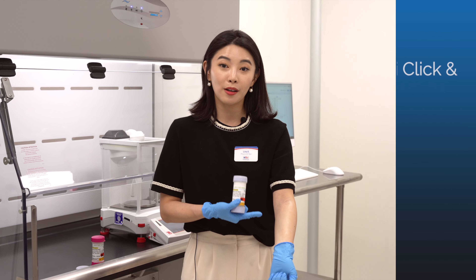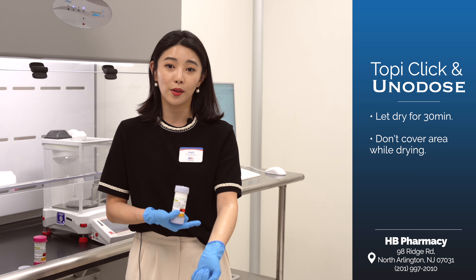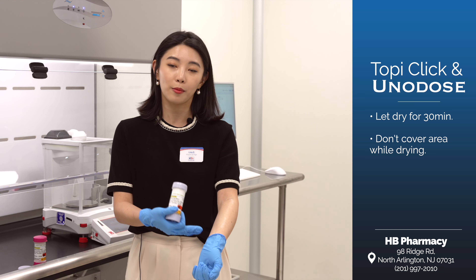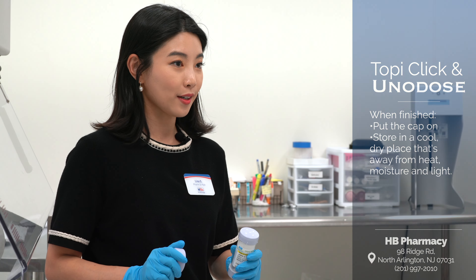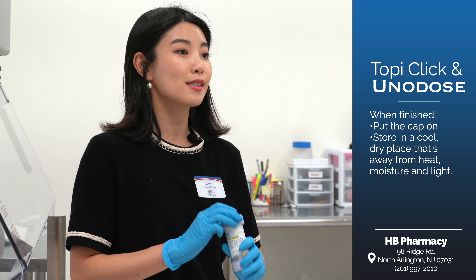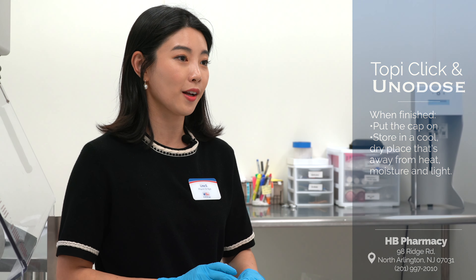Now the cream is all rubbed in. Make sure that it actually dries up — give it about half an hour and make sure that you're not covering it with long sleeves or transferring it to a different surface area. Once you're done, put the cap back on and store it in a cool, dry place away from heat, moisture, and light.